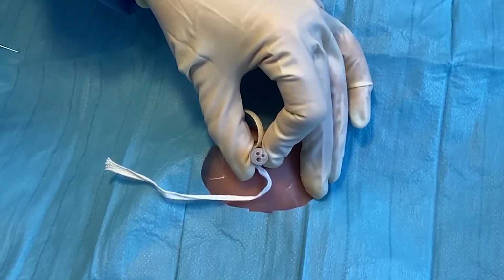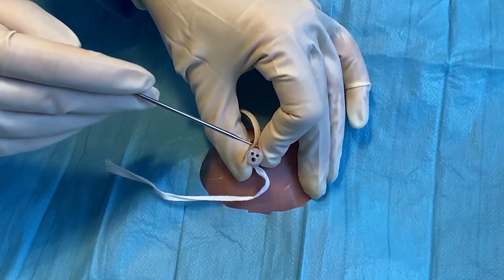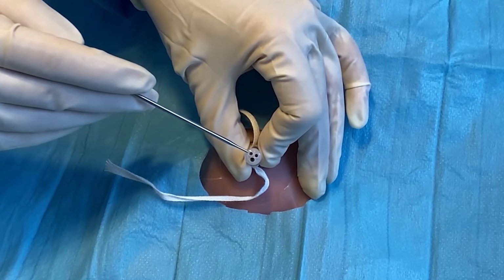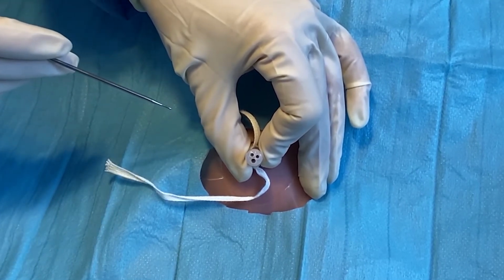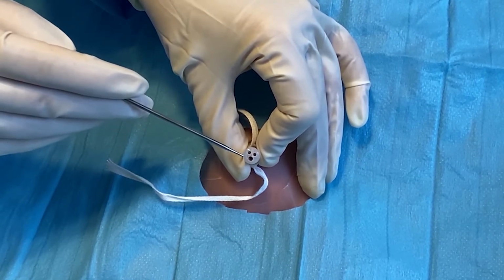So now you're going to identify your vessels. There should be 2 arteries which are smaller and have more muscular walls, so tend to stand proud of the cut cord. And then there's a larger vein which has thinner walls and so tends to gape.